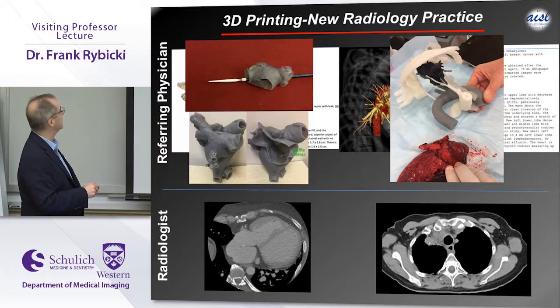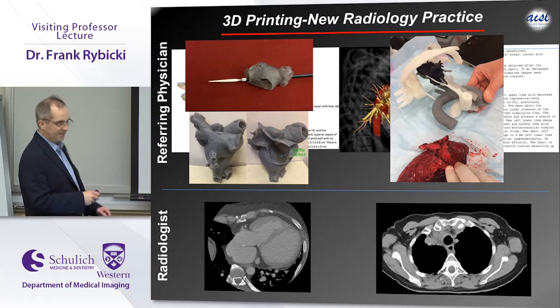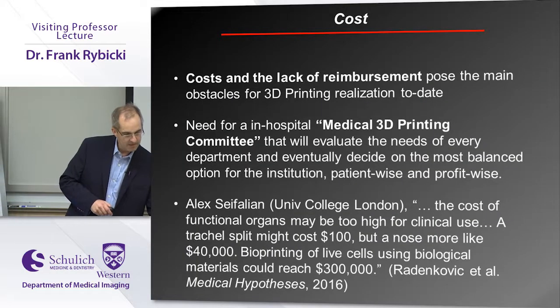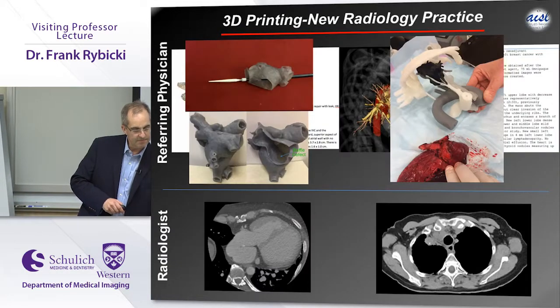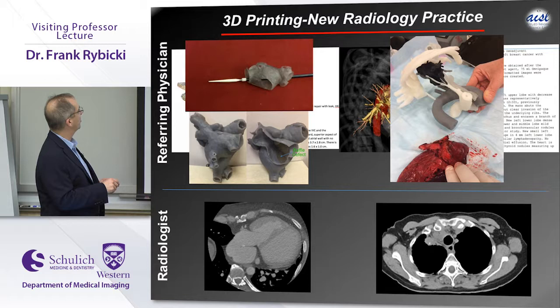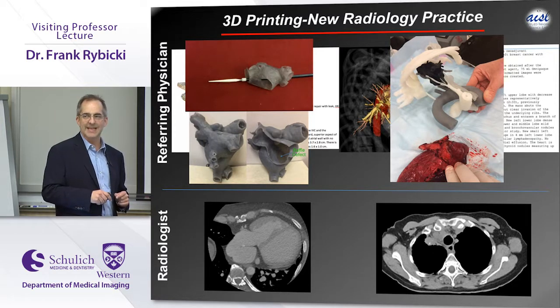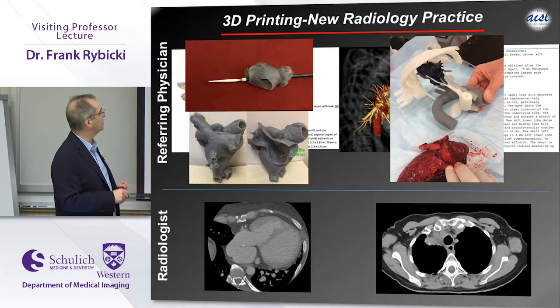As soon as you actually give someone the ability, the video might not work. Oh, shucks. This stent deploys. As soon as you give the cardiologist a chance to actually pick the stent and deploy something that's actually in the model, they'll always do that first.